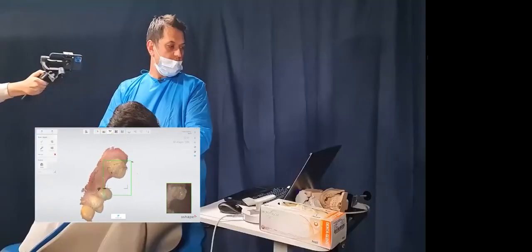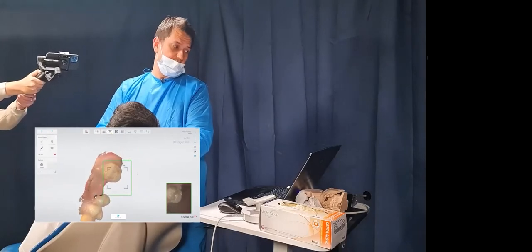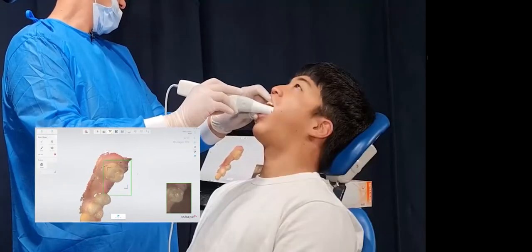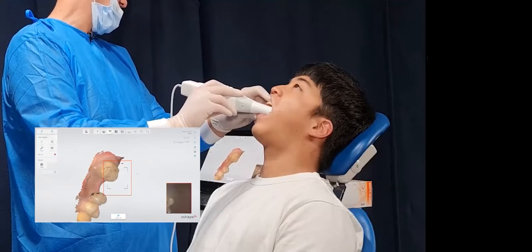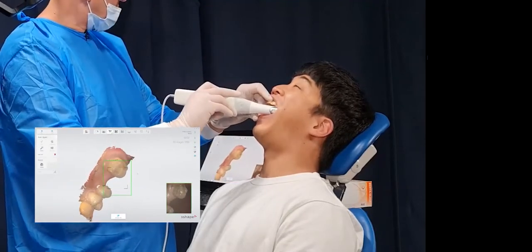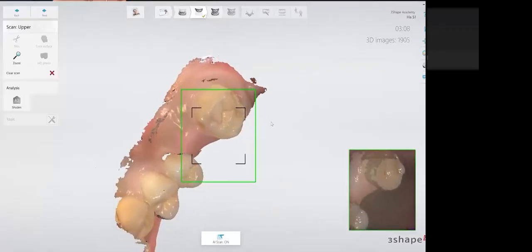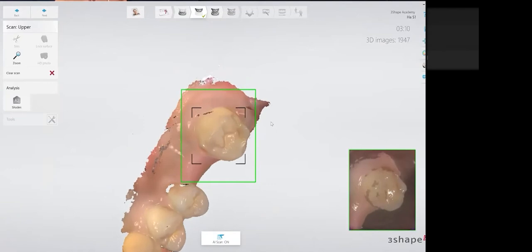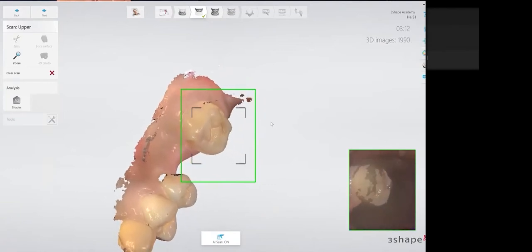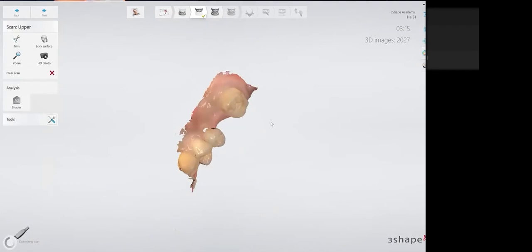Again, rolling around, it's really testing it, and I guess with live TV you've got to take this into account, don't you? But as we almost got it there, you can see your scan count is really driving and growing. I want to get that just to show you how we go there. Sometimes saliva plays a part in this as well. There we go, we're almost there, and we got it. There you go. So it's not always easy.